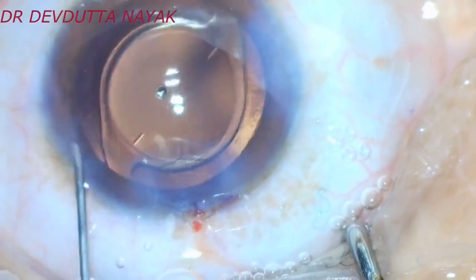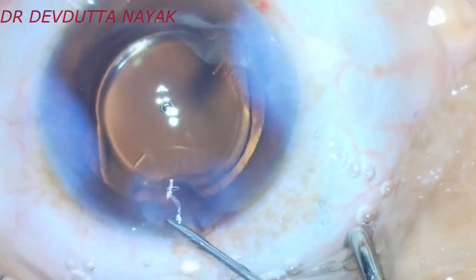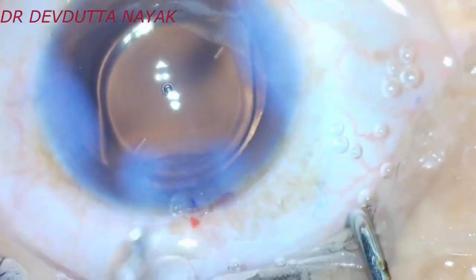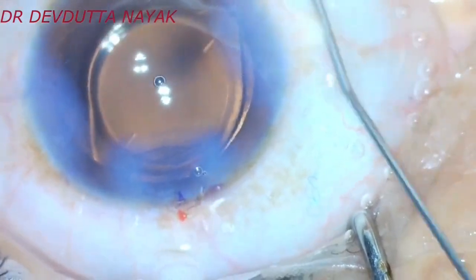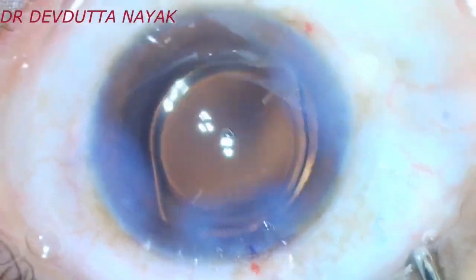And before removing the irrigation, I prefer to hydrate the side port, and then I removed the irrigation probe and then again I hydrated the other wounds. So now the case is complete. Thank you very much.